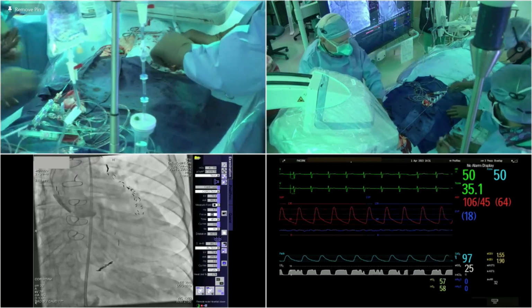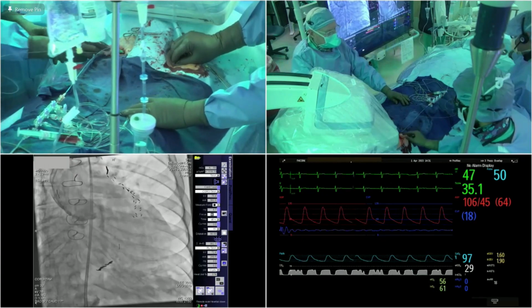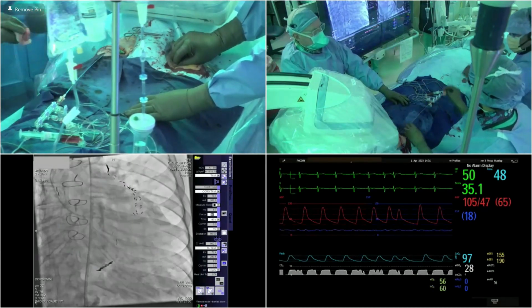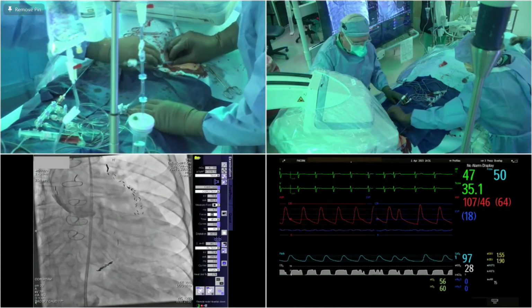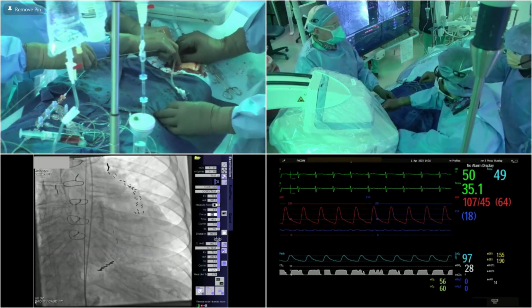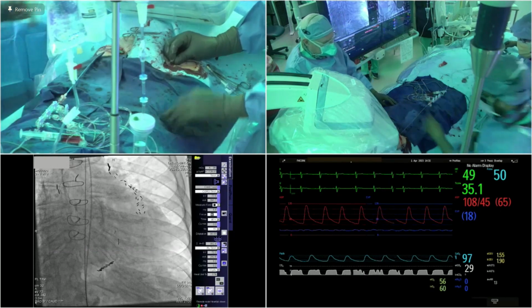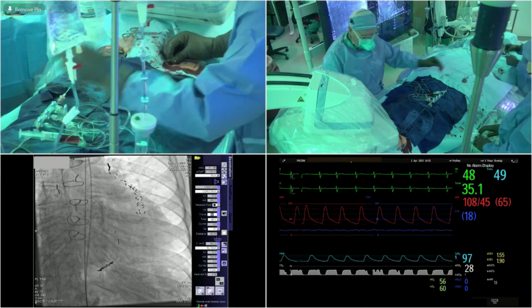One thing I want to point out is that in real time, we've actually been working about 15 minutes. I want to introduce as well Chris Mullen and Dustin Garavelli. They are the representatives for Medtronic in this case. So Dustin, when we first started doing TAVR, to get to this point, how long did it take? Let's put a JR on that, please. Sentinel. So he said 3 hours and a lot more people in the room.